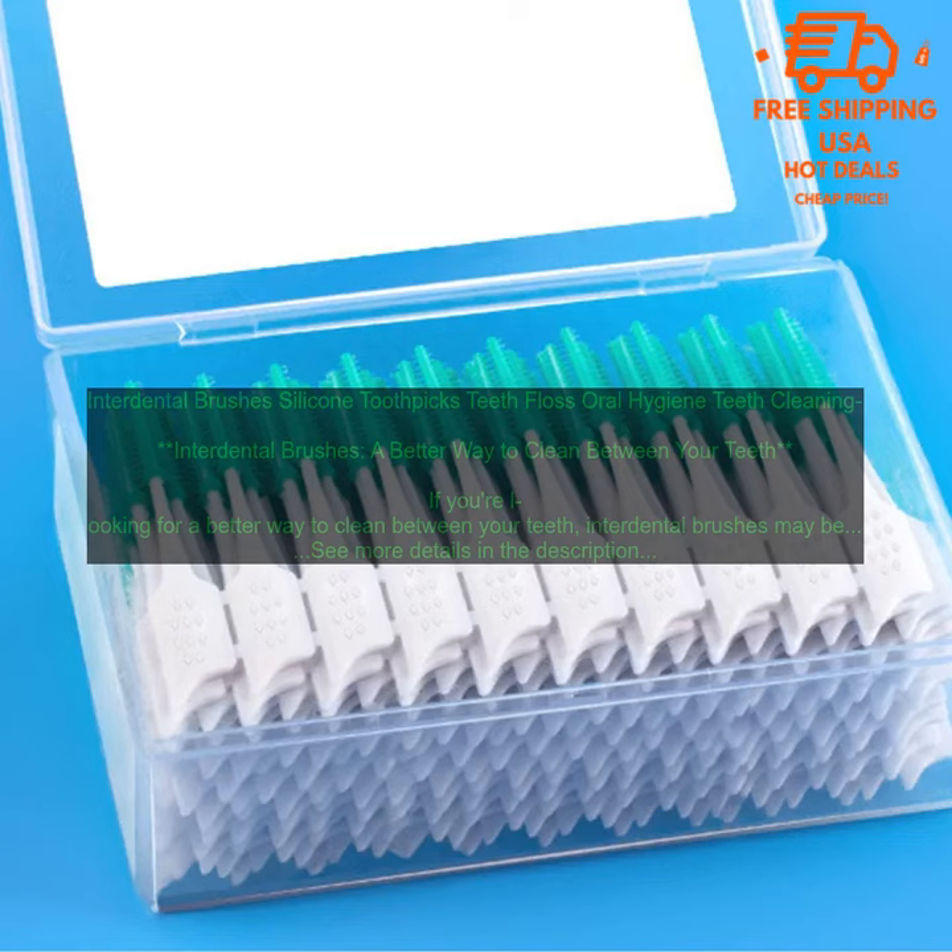Interdental brushes: a better way to clean between your teeth. If you're looking for a better way to clean between your teeth, interdental brushes may be the answer. These small, soft-bristled brushes are designed to reach into the tight spaces between your teeth, removing plaque and food particles that regular brushing can't reach.